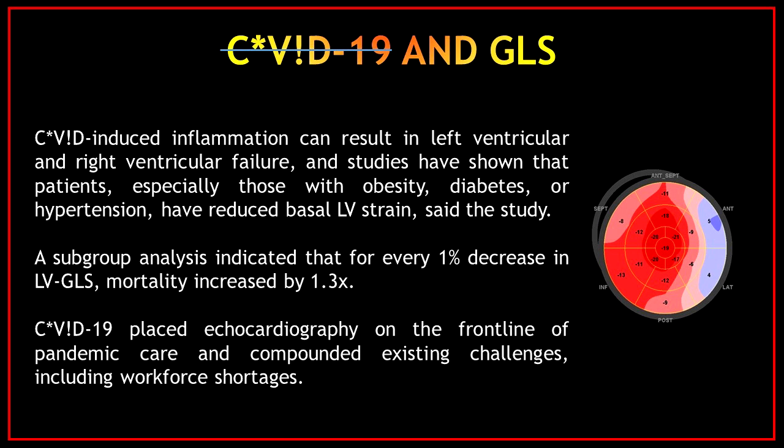A subgroup analysis indicated that for every 1% decrease in left ventricular global longitudinal strain, mortality increased by 1.3 times. This virus placed echocardiography on the front line of pandemic care and compounded existing challenges, including workforce shortages.